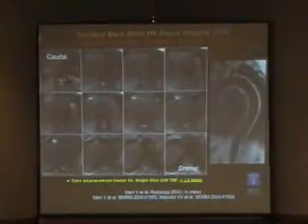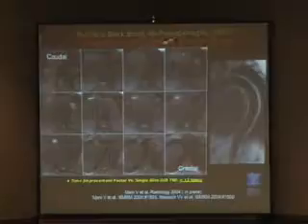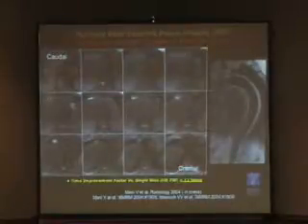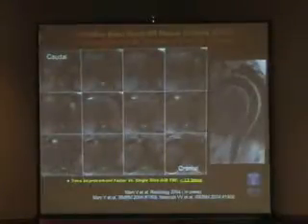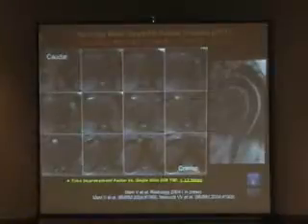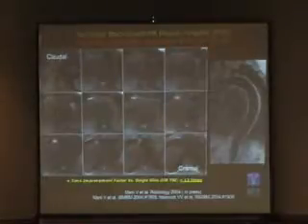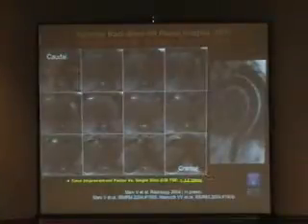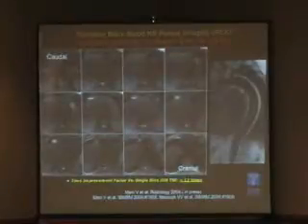If you want to combine this with cross-sectional images to obtain quantitative volume of plaque, you can obtain 12 slices in less than 3 minutes. So the whole thing can be done in 15 minutes, including the preparation of the patient, etc. So you have to look at this very critically and not just brush it off saying, oh, well, it's complicated and it takes a lot of time to do. Especially with recent advances in imaging, a lot of what you may be seeing in the literature, that we or others published a few years ago, 5 years ago, we can now do 10 times faster. It didn't stop there and will not stop there.